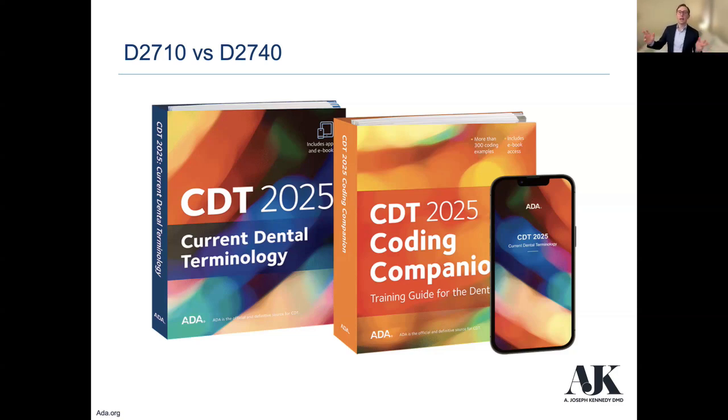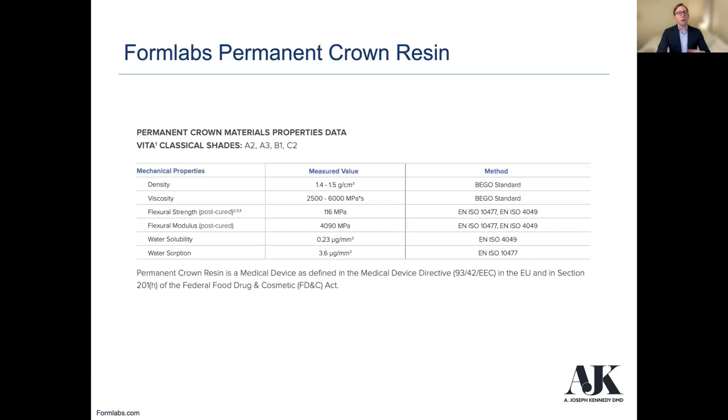Now, again, I'm not advocating for this. I'm just sharing that information. I would be a little reluctant to do that as I don't think we truly know yet how long these crowns are going to last because they haven't been tested in the mouth in our patients long enough to be using it definitively, in my opinion. But it's just something I did want to share, that if you do call the ADA and ask, they may say that the 2740, by definition, if you're using material that has greater than 50% of that ceramic impregnated in the resin, you're okay.